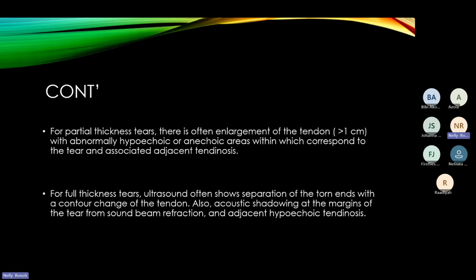So what usually happens in tendinosis is that it would appear heterogeneous. That would be a mixture of hyperechoic and hypoechoic. But in tendinitis, which is the inflammation, in most cases it would just appear hypoechoic, because the tendons naturally are hyperechoic. So they start becoming hypoechoic and thickened. And when you put color Doppler, it would be hypervascularized. It would appear to have more vascularity than the normal.